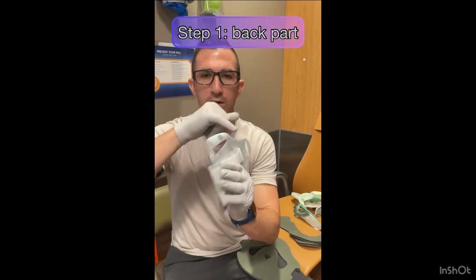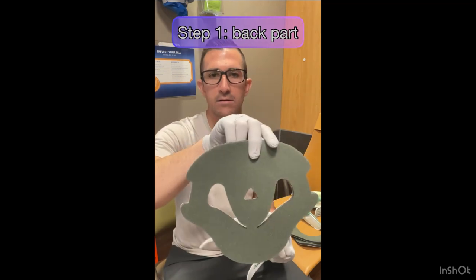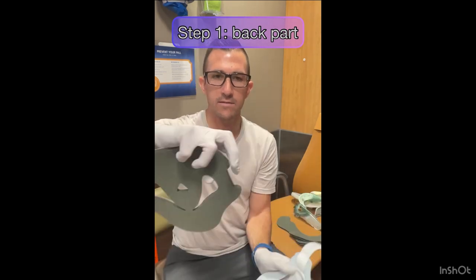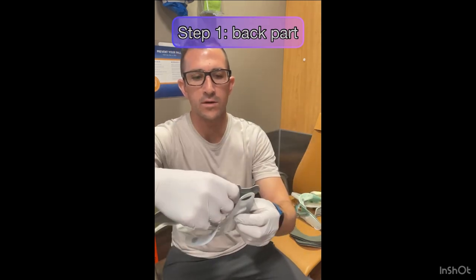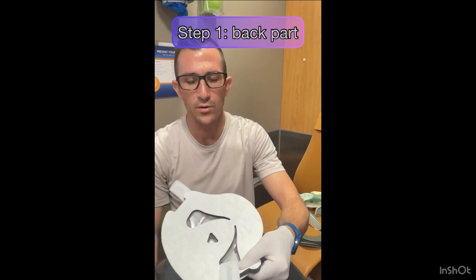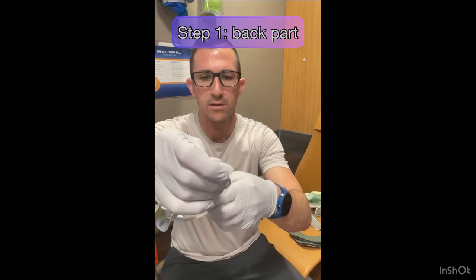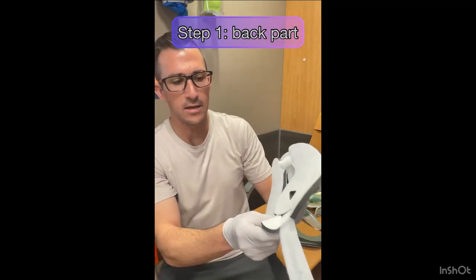It should look like this, so you have nothing in this part here and nothing in this part here. Then we're going to take the pad - the pointed part is down - and you're going to take this column and line it up with that column on the firm part of the brace. Then take the strap and pull it through, going over the top of that column on the pad, and then put it through the slit and pull it tight.